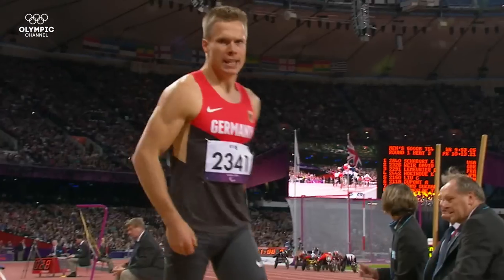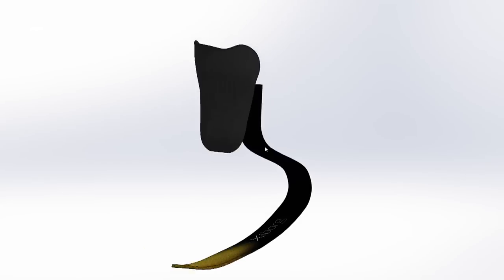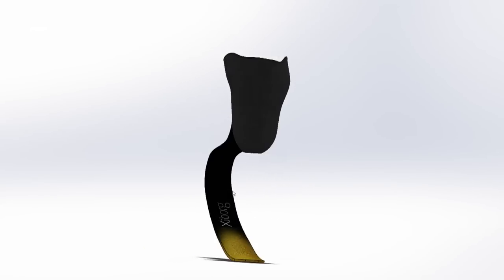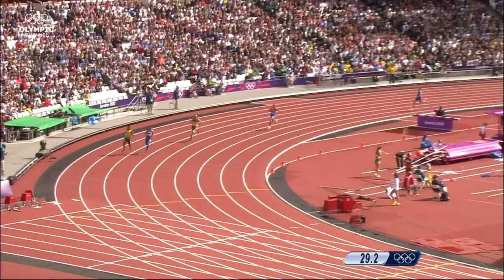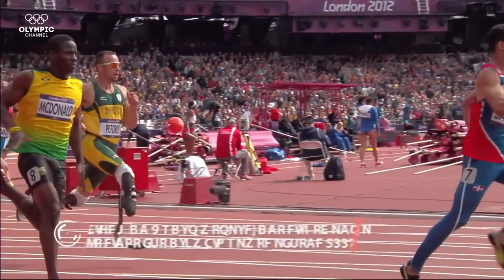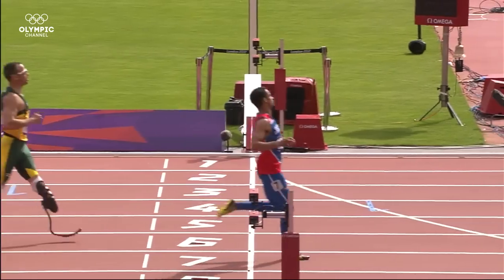Not everything can be achieved by technology alone — training is just as crucial. Training hard and advances in technology have shown their results. Oscar Pistorius created history in the Olympic Games London 2012, where he became the first amputee to reach a 400m semi-final, running with prostheses.